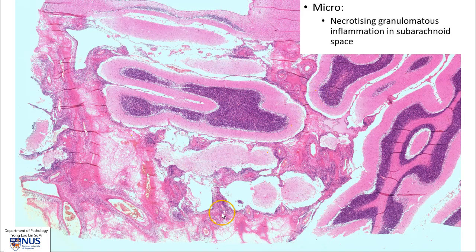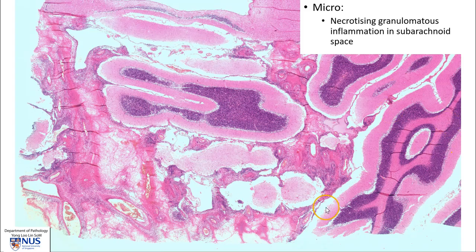Microscopically, within the subarachnoid space, we will see the characteristic inflammatory picture of TB, which is that of necrotizing granulomatous inflammation. Here we can see again at low magnification the cerebellar parenchyma, and this is the markedly expanded subarachnoid space, which contains lots of blood vessels as well as necrotizing granulomatous inflammation.